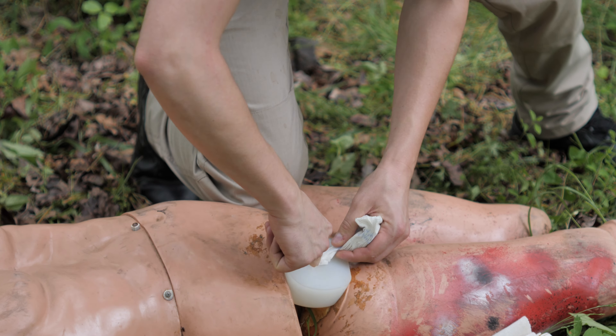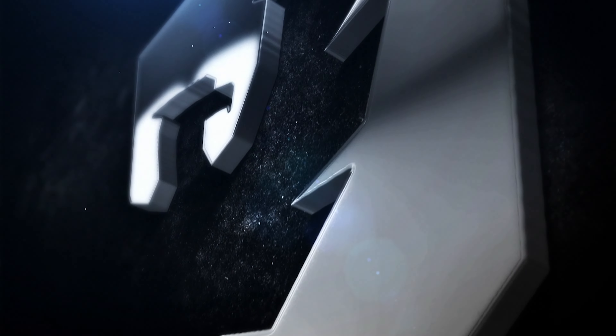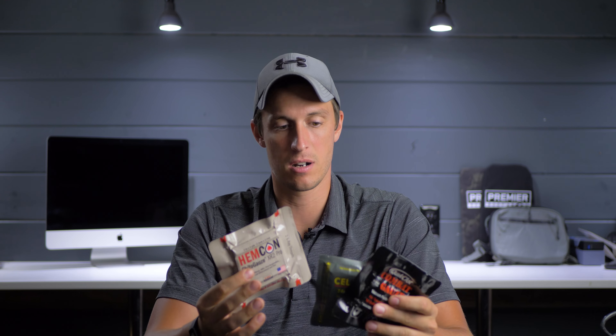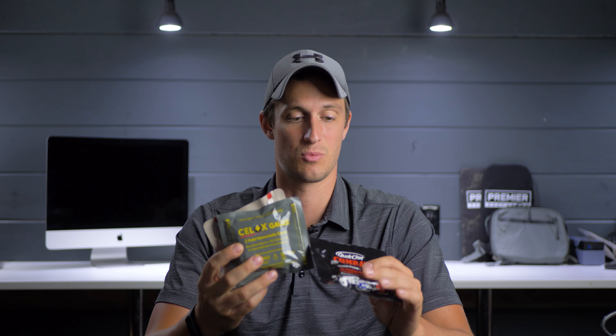Today we're taking a look at hemostatic gauze. We're going to talk about the different types of gauze available on the market, and we're also going to talk about some myths that still seem to be floating around out there. We'll look at some of the differences between types, answer questions about which ones you should have and which ones work better, and at the end of the video we'll address common myths about hemostatic gauze and hemostatic agents for bleeding control.